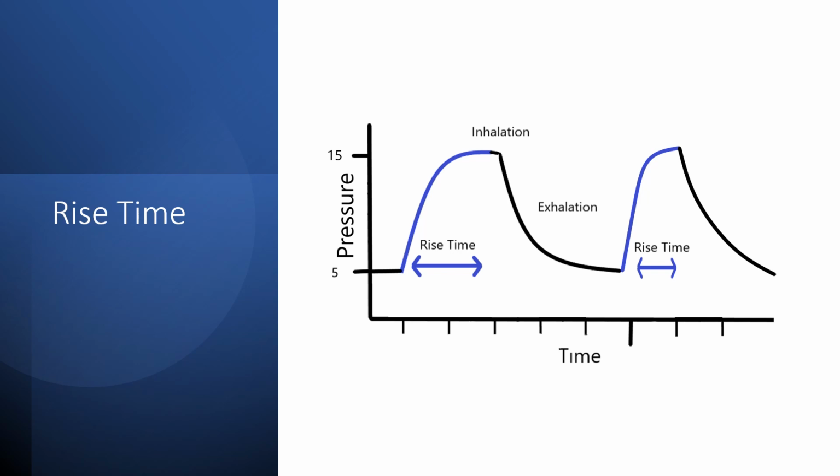And so if you pull quickly, you'll notice, especially if your rise time's high, that you're pulling faster than the machine can keep up. And so you'll pull in, or you'll pull out, I'm sorry, and then the machine will give the breath on top of it. And so if you think about the patient, that's what's happening when you see asynchrony in the bronchospastic patient. They have this very quick inspiratory phase, and so they breathe in and they have to pull the air from the circuit through all of that hose, through the vent itself, and about the time that they've already finished breathing in, the machine's just kicking in, it's just catching up and trying to push that breath in, and they're ready to be done. And so then you get that asynchronous breathing pattern.